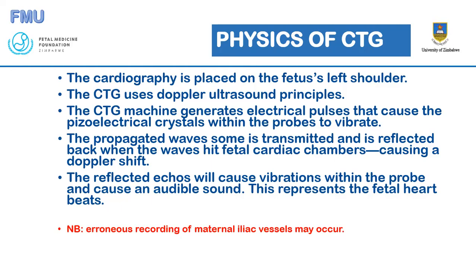It has occurred with the machines before, maybe because people do not have the knowledge that this is a gadget whose components can be displaced by dumping it forcibly, or it could be because people hate themselves so much that they want to destroy the things that they use. But we need to have this knowledge that it is just like an ultrasound scan probe. Please don't throw it away, don't dump it, handle it with care. It's a delicate piece of instrument.